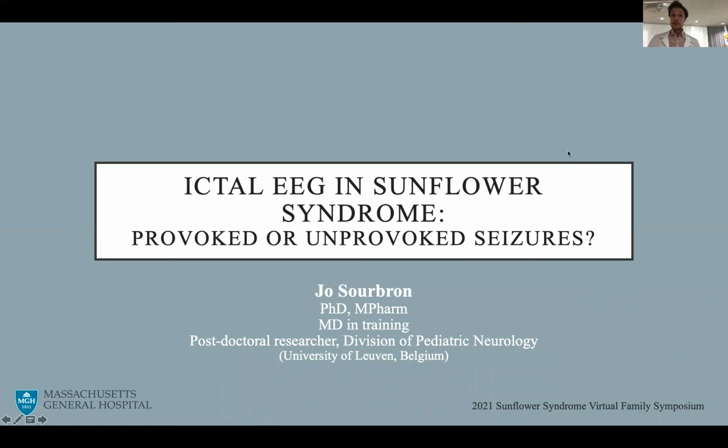Hello everyone. Today I will talk about the Ictal EEG in sunflower syndrome. Are the seizures provoked or unprovoked?